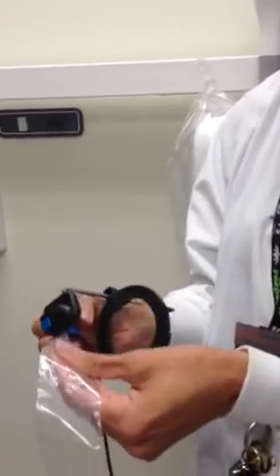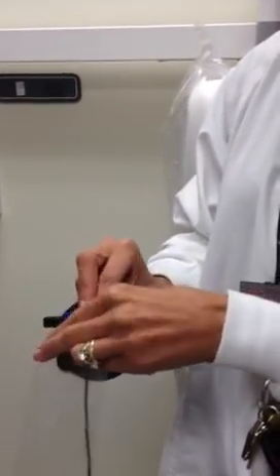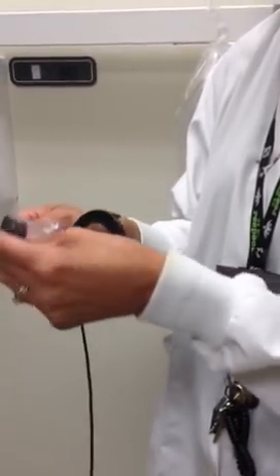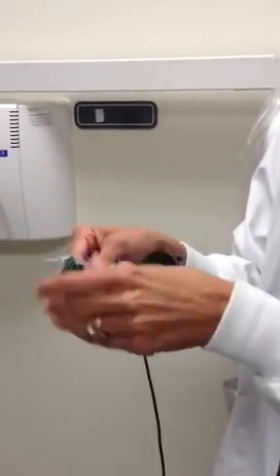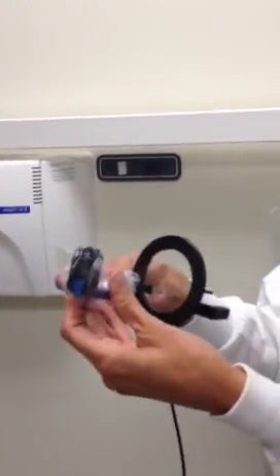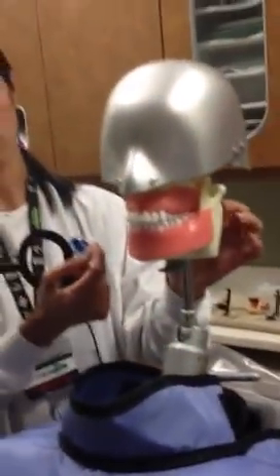You want to make sure that the client isn't biting on it, so you want to make sure that it's flush. Then we want to barrier it. At this point you would have your gloves on and all your PPE if you're working on a real client. You want to ensure that the whole sensor and the holder is covered.